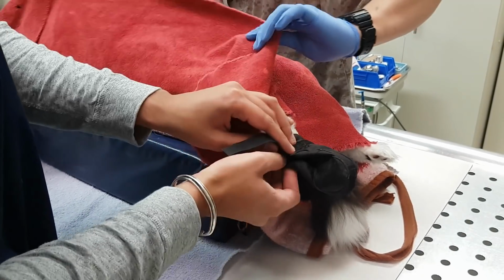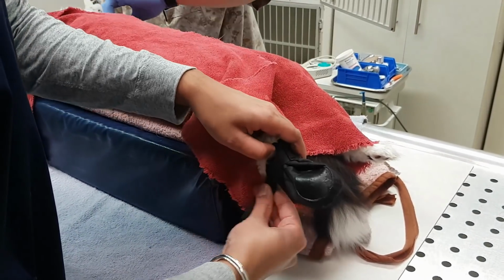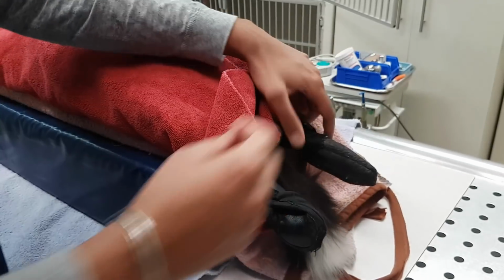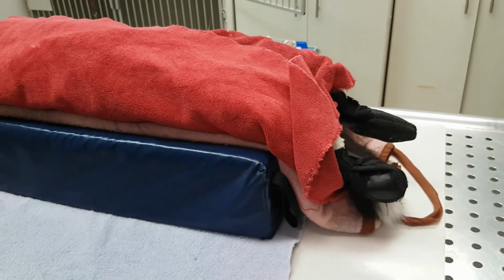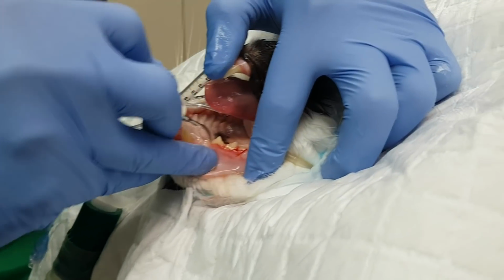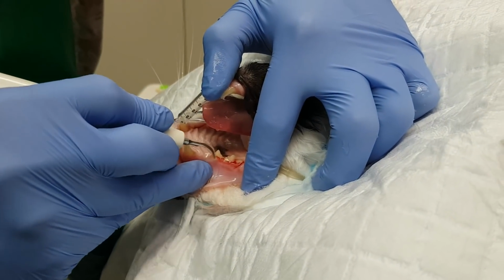They're really warm, and cats lose a lot of body heat through their paw pads. Putting little booties on their feet like this will actually limit heat loss under anesthesia, and I can confirm that this works really well and is also adorable. We'll often put little booties on all four paws for longer procedures.